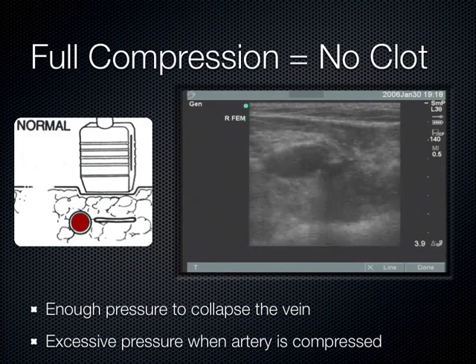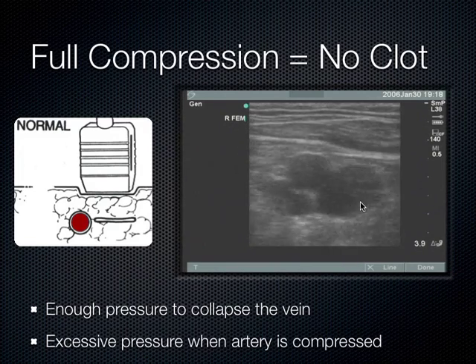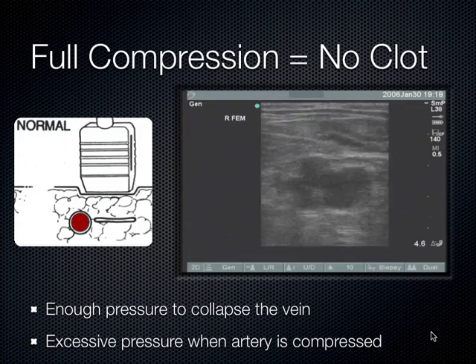This is what it looks like on video when you're doing it. So the superficial and deep femoral arteries have bifurcated, and we're seeing the common femoral vein here, easily compressible.